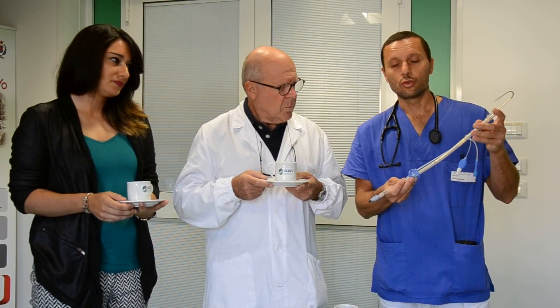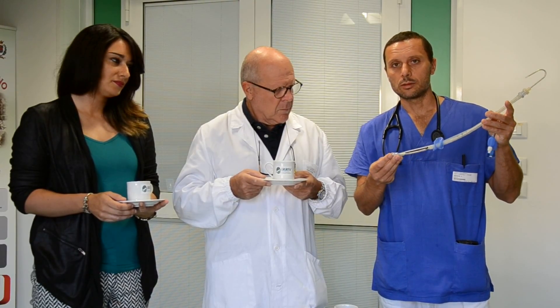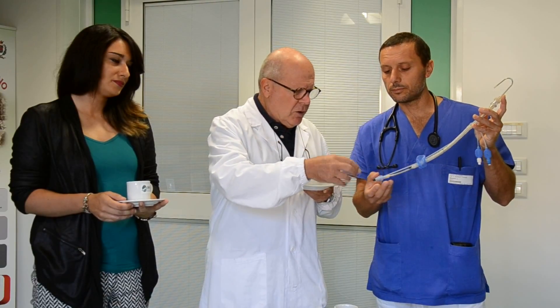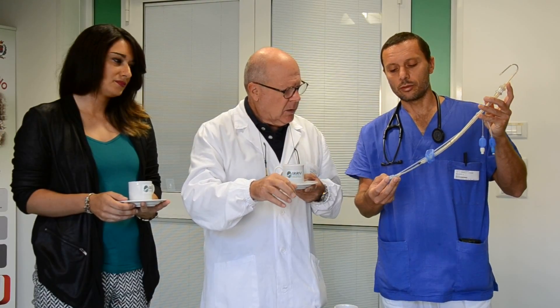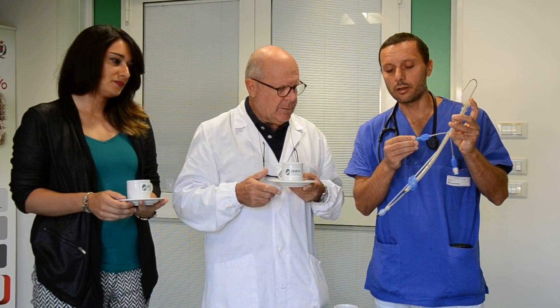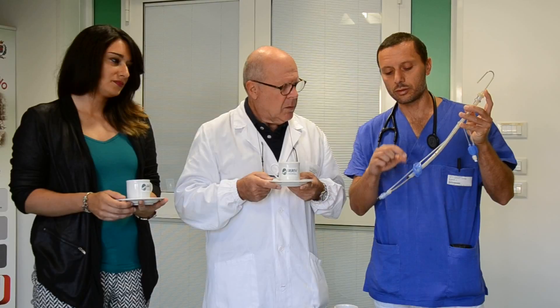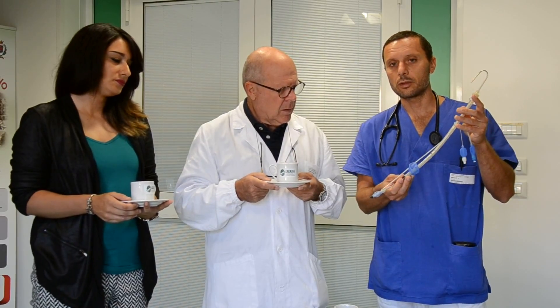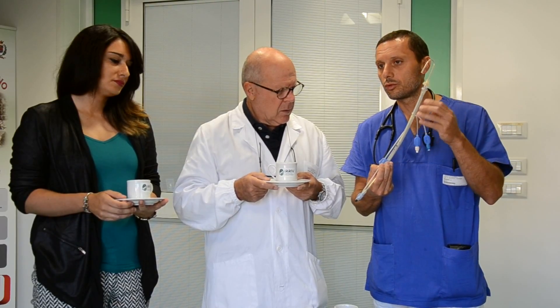It consists of a tube of silicone with two cuffs that are joined by a flexible tab. The distal cuff is designed to seal the esophagus, and the proximal cuff seals the oropharyngeal area proximal to the epiglottis.